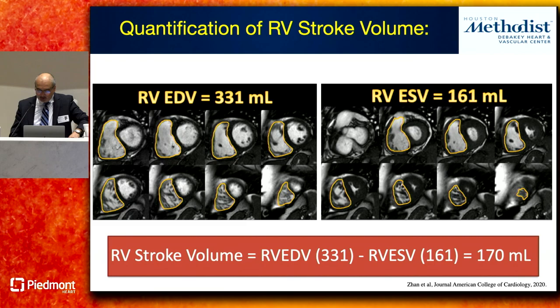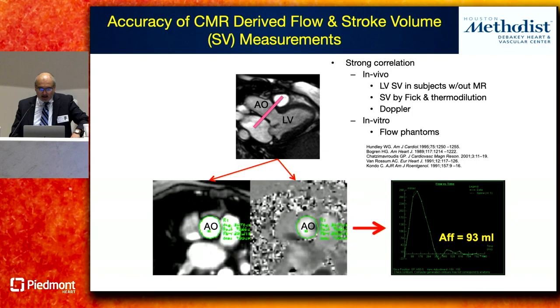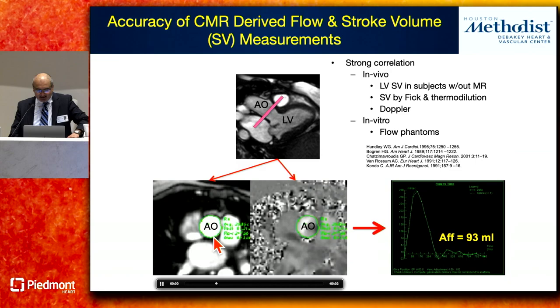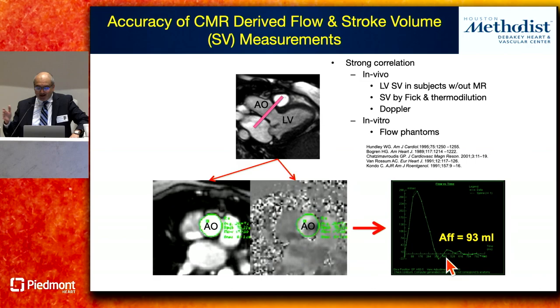Phase contrast CMR is kind of the MRI equivalent of echo Doppler. It's a velocity map — here we've done it in the ascending aorta. By simply drawing a region of interest, we can get a processed flow curve showing what the flow is across the entire cardiac cycle.